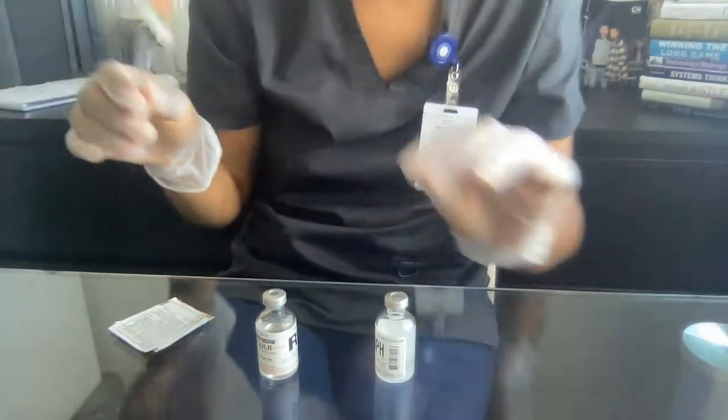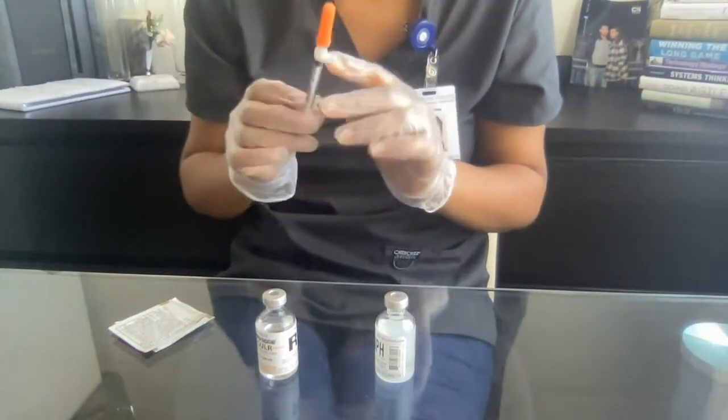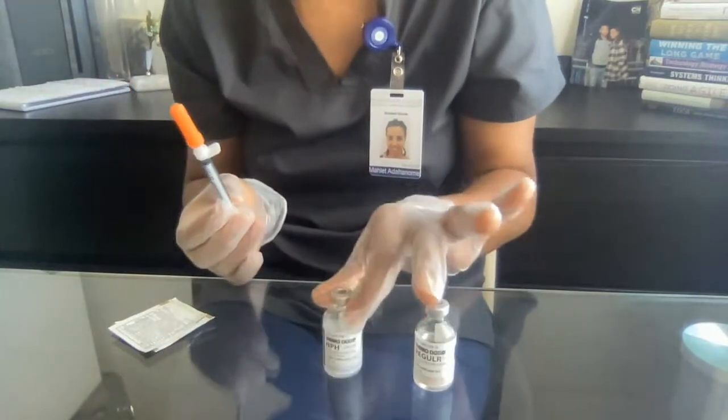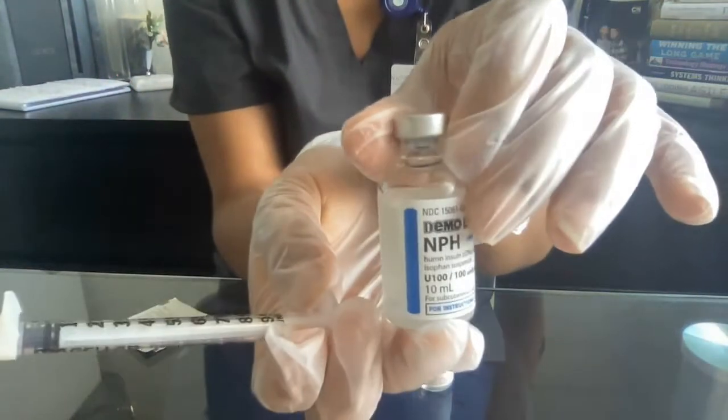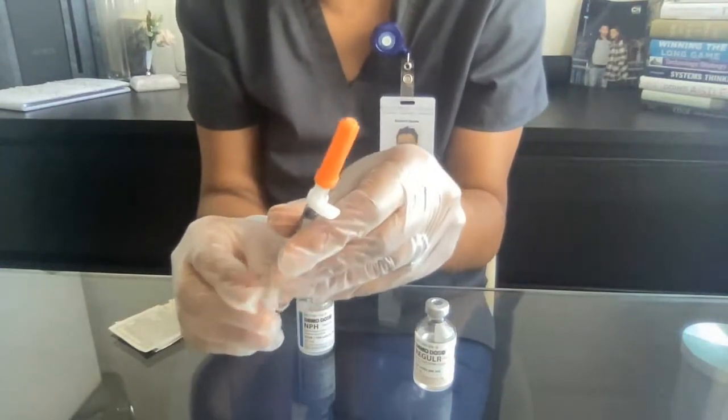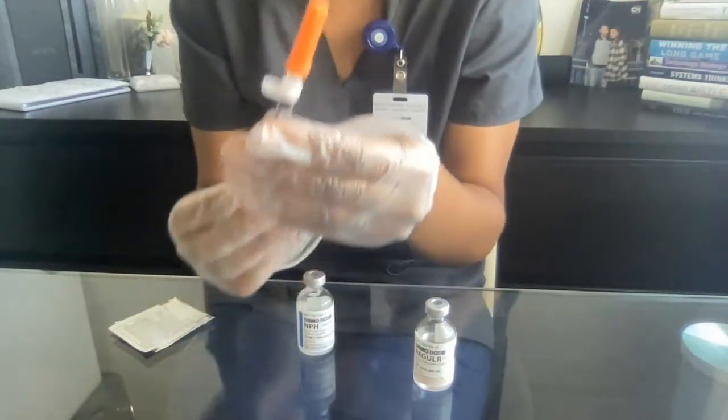So I'm going to start injecting air. For this order, I was given 8 units, so with the cap still on, I'm going to draw 8 units.